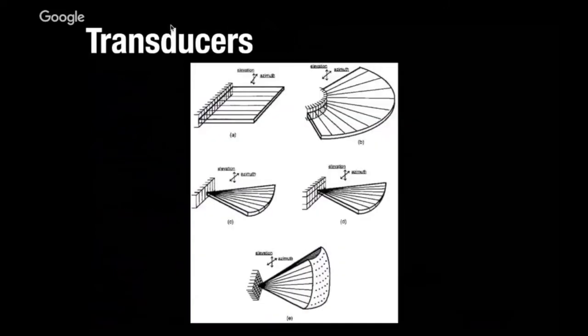And then you've seen me do this for the probe face a bunch, talking about, oh, the probe face is just this linear line that moves up and down like this. But if you open up an ultrasound probe, these are what you find. You find a whole bunch of different arrays of crystals, different faces in different directions.